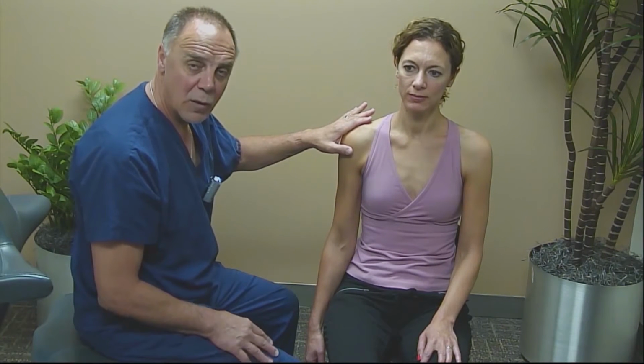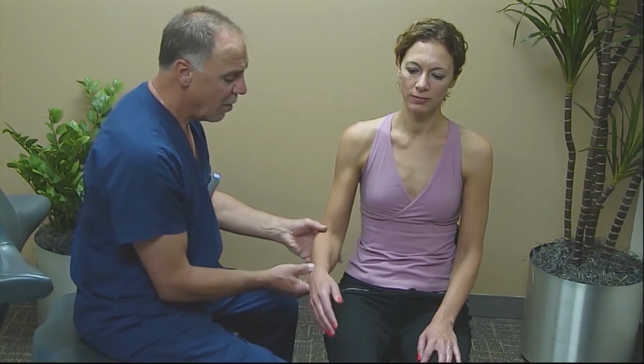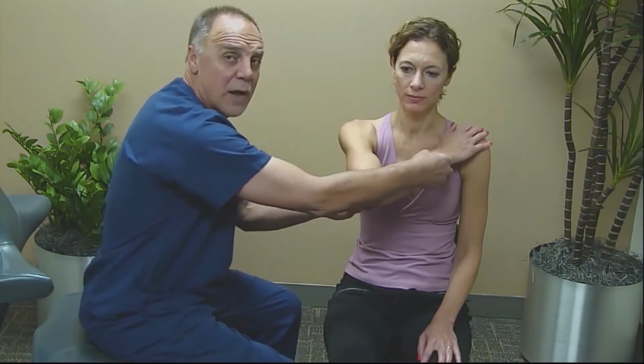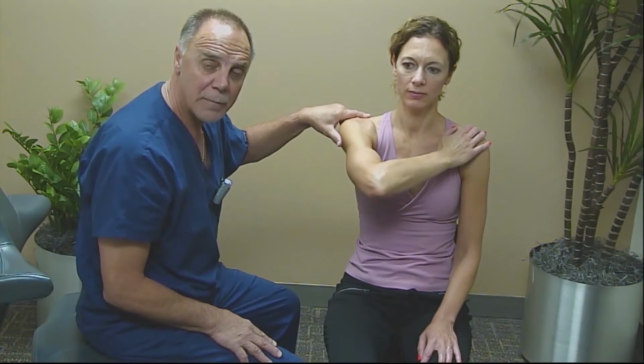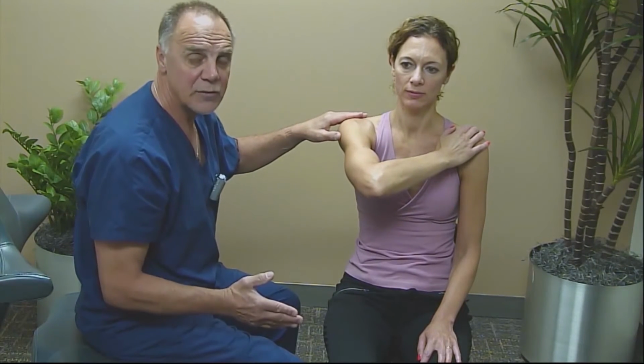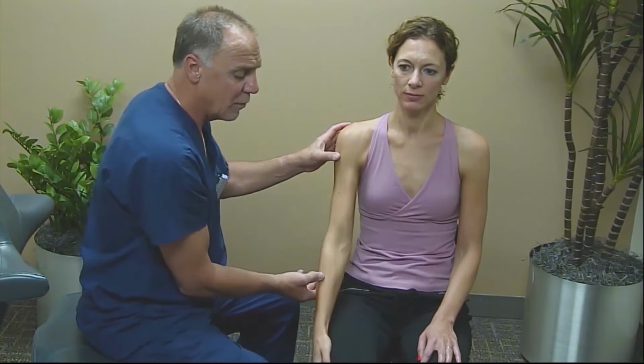Placing the transducer on top of that and taking an image, then asking the patient to bend their arm, put that hand across on their contralateral shoulder, and then we will take another picture of that area. It is common practice to look at both AC joints, so you might want to dress your patient such that you can do that. We let the patient relax their arm back down.